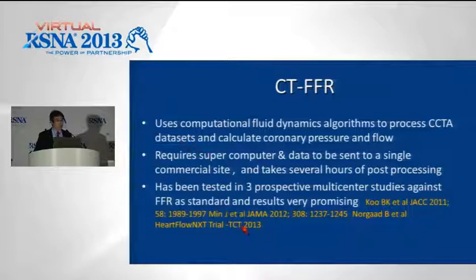As I said, this uses computational fluid dynamics algorithms to process the data from your scan and calculate coronary pressure and flow. It requires a supercomputer and data to be sent to a single commercial site, and it's not cheap, and it takes several hours of post-processing. But it has been tested in 3 prospective multi-center studies against FFR as a standard, and the results are very promising, and the latest was just presented in October at TCT.